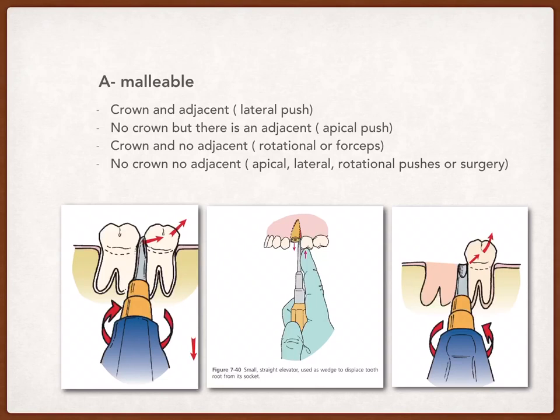Okay guys, the fourth and last case is when there is no crown and no adjacent tooth.